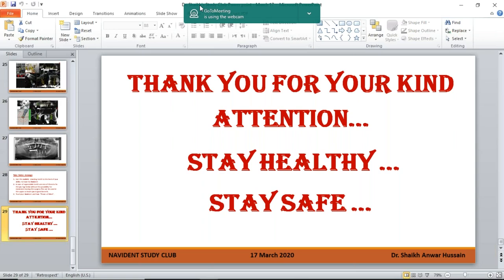I'm trying to put it in daily use at this moment, but it's a little difficult because two things are happening. From the point of view of costing, for patients who are insured, we do not get covered for splints, etc. So I'm trying to use them as much as possible, but sometimes I'm using them at my cost. The license goes at my cost. So that's one part. Secondly, I use them when I find the patients will be cooperative with it. Because it's a difference between country to country of how the patient's cooperation comes when we are using Navident.